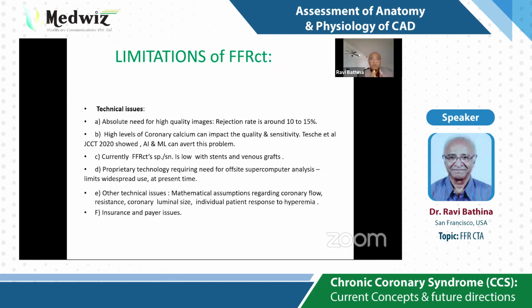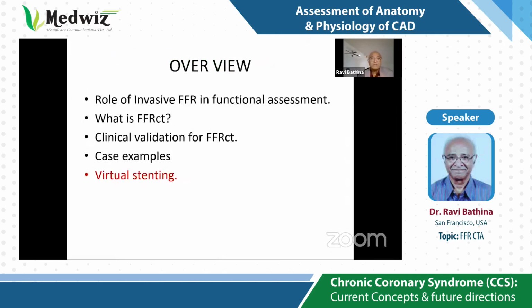Proprietary technology requiring off-site supercomputer analysis limits widespread use at present time. Hopefully in the near future, this bottleneck will be opened up. Other technical issues, we are taking a lot of assumptions here, mathematical assumptions of coronary flow, coronary resistance, and individual patient's response to hyperemia. Of course, usual problems of insurance and payers.